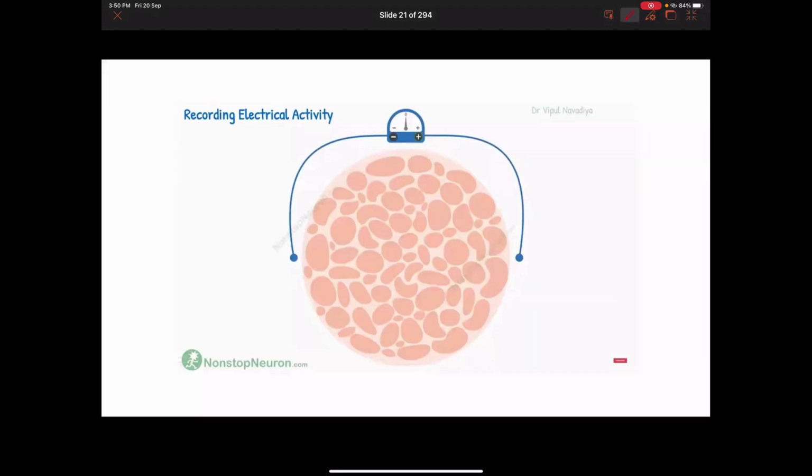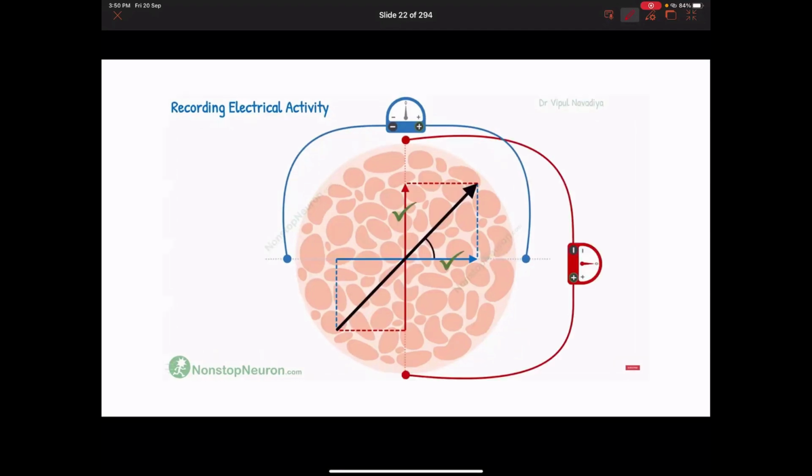Basically, imagine that this is a cross-section of the heart cells, okay? We have impulses traveling in this direction. They can easily be read by this. This basically is the lead that we talk about, like the leads for the ECG, okay? We have this lead that can read the impulses moving this way. Now, what if we have an impulse also going this way, or a wave of depolarization going this way? Will this blue lead be able to detect it? It's very hard because it's not really aligned with it.